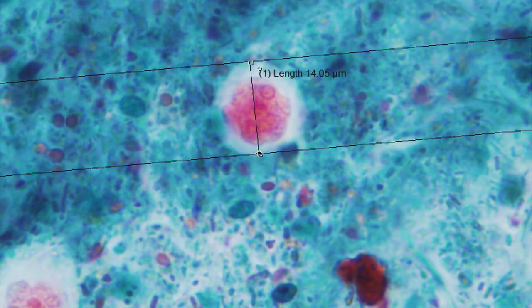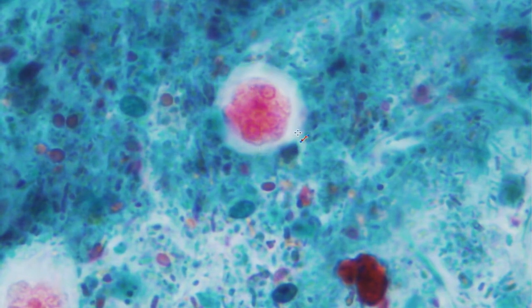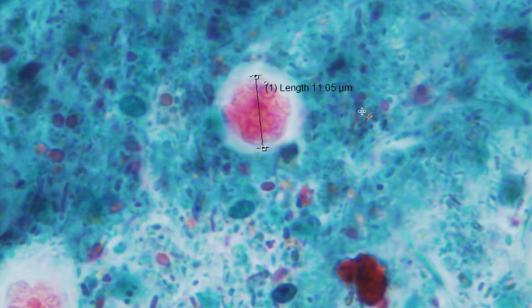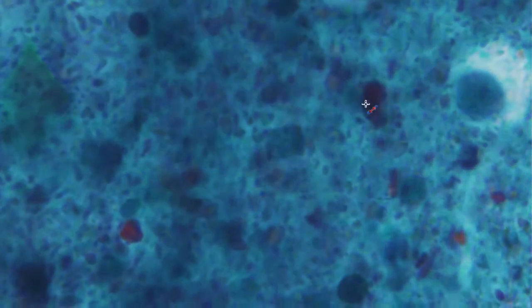there we go, 14 micrometers. That is the true size of that cyst, 14 micrometers. If I had only measured the cyst itself here, I would have said it was 11 micrometers. And that is not the true size because it's shrunken. So a very important trap for new players. Don't measure the size of the cyst when they've shrunk. Measure the actual zone or the actual halo around that shrunken cyst.